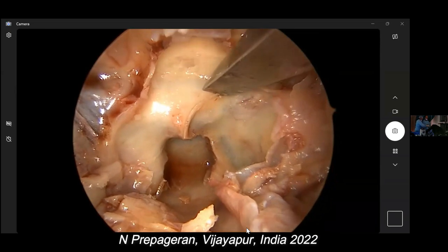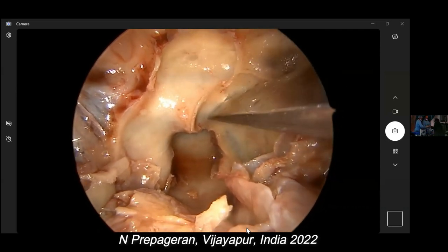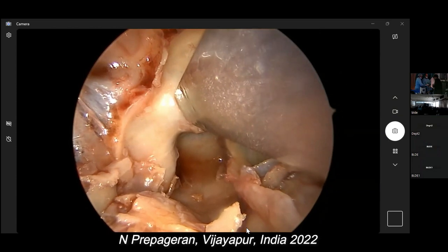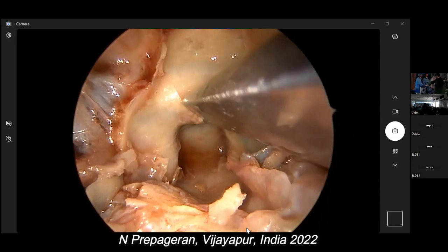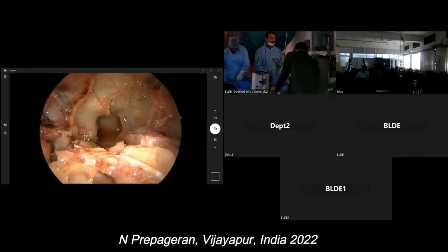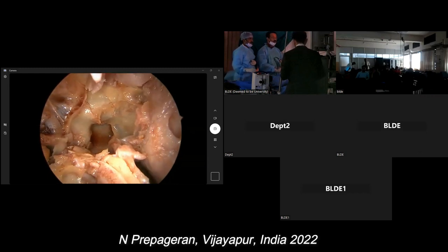Bang. Slowly. Don't bang my hand. We're friends, right? Okay. Bang. You see how hard it is? This is made in India, right? Such a thick bone. Ball probe. But we have a master craftsman here, so we should be okay.